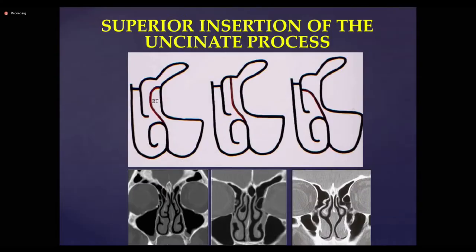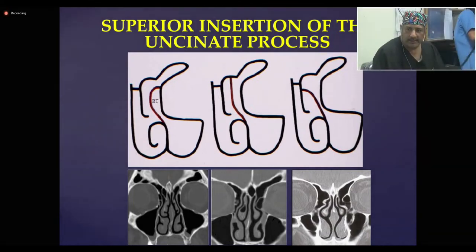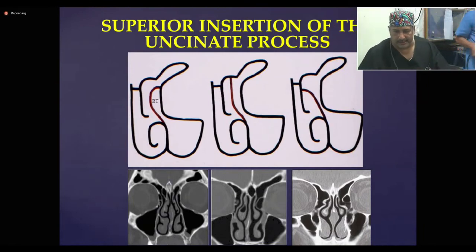Yes, sir. So once it comes to frontal sinus surgery, you have to be, first of all, well versed with the anatomy, cellularity, and the structures in the vicinity of the frontal drainage pathway, which can complicate the frontal sinus surgery. Frontal sinus surgery is always considered challenging for certain reasons. Number one is its strategic location, lying superiorly and requiring angled telescopes to visualize inside. So you have to be well oriented with the angled telescope to do a desirable job.